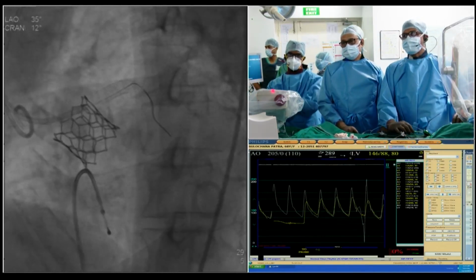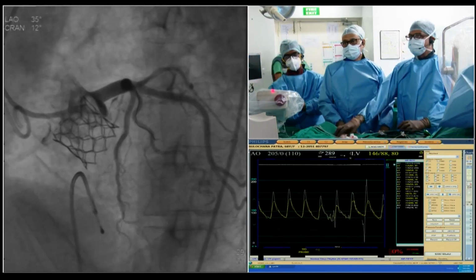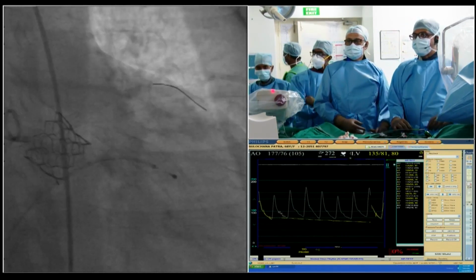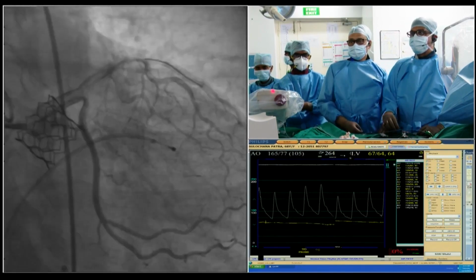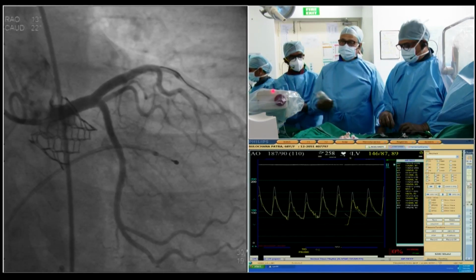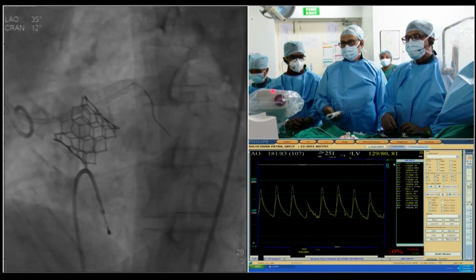And I think I'll be okay if now taking it out and waiting for 15 minutes. We are in the room. We'll go offline and then we'll let you know what happened to the patient afterwards. Okay. Yeah, I'm happy with this. Okay. Yeah, looking at this, I mean, we stented it just to be on the safer side. Would you like to take a cranial view just to be sure that the ostium is clear?